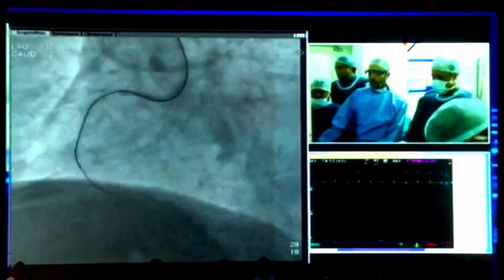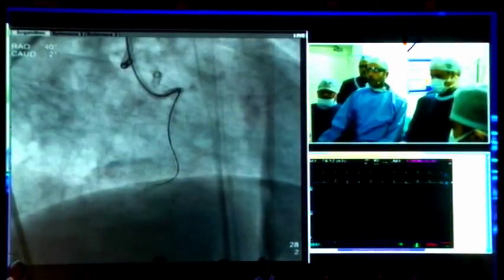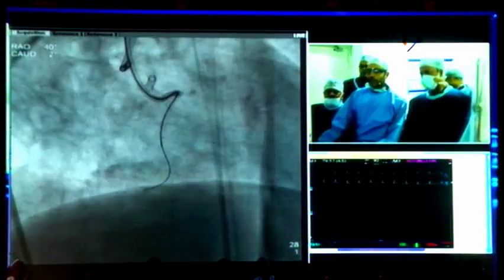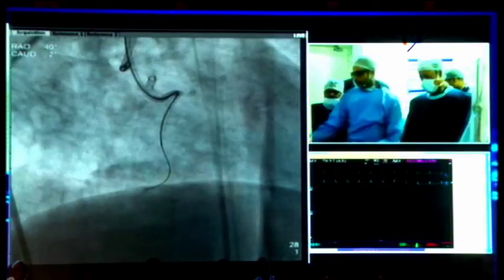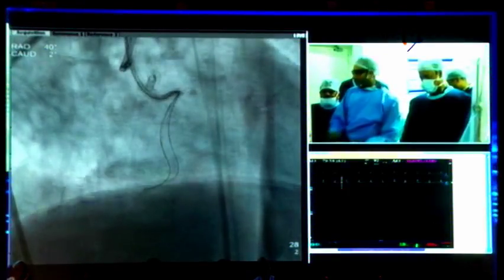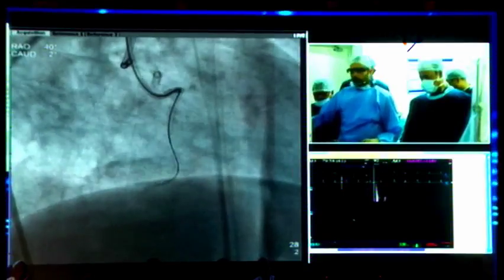Back. There you go. Okay, good. So in the same view, I took a Gaia Second. I went by feel and stayed away from the branch. I stuck into the RCA, and that's a cine of that.